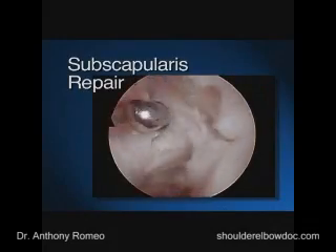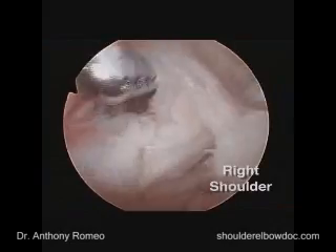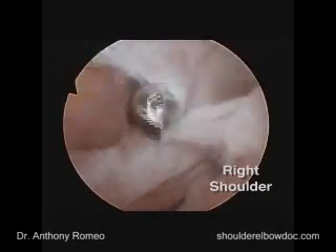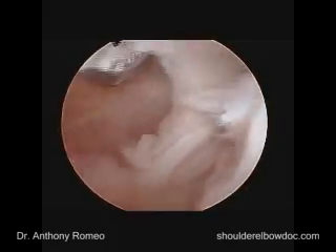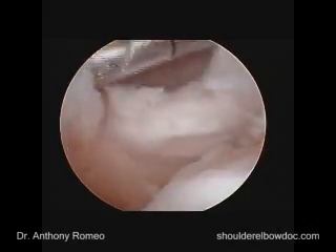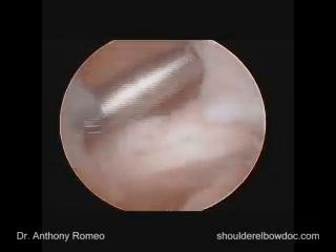The first thing we need to do is resolve the subscapularis problem. To do that, we're going to open up part of the rotator interval to give ourselves a better view and space to work in this area. Opening up the rotator interval involves taking out part of the superior glenohumeral ligament, which is not a problem with instability and is necessary for visualization. We'll also trim off a little bit of the medial glenohumeral ligament so we can see all of this well.